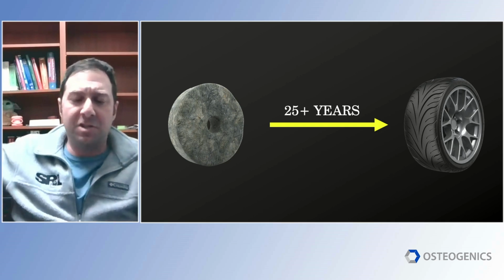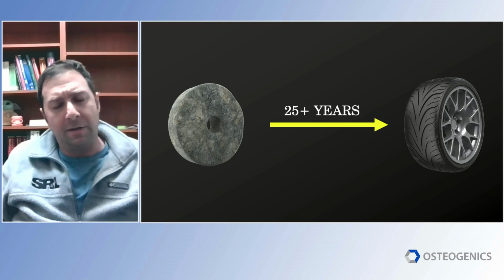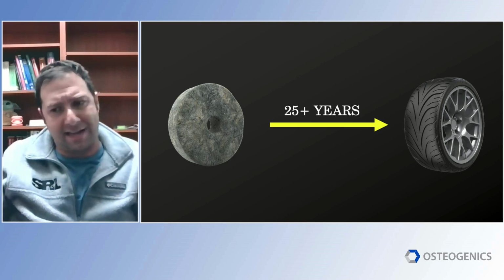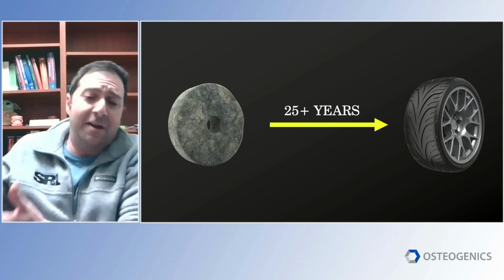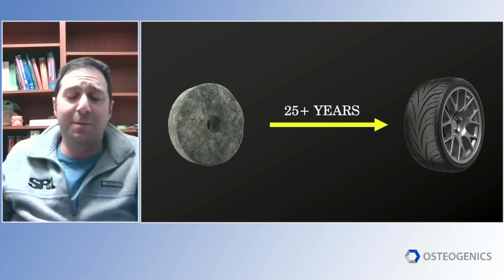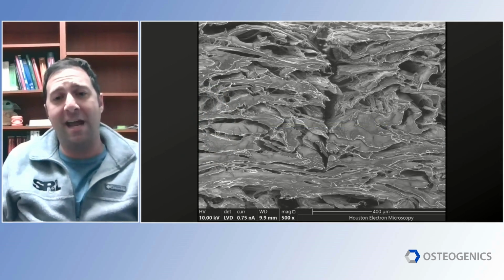It's like when we took smooth surface implants and made them rough, right? It wasn't people like, oh, I don't know about that rough an implant. No, it's an implant. They just made it rough. And because they found, okay, you increase the surface area, it heals better. Well, guess what? That's the thought process with microderm, with microsurfaced allograft.